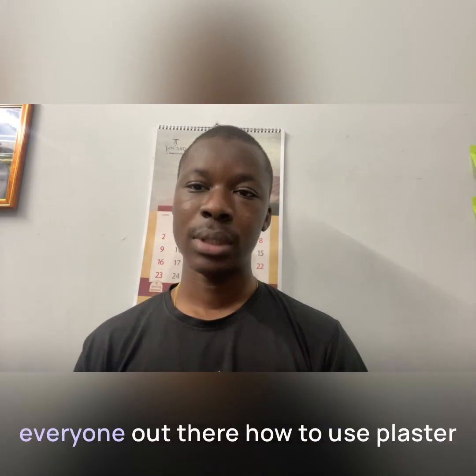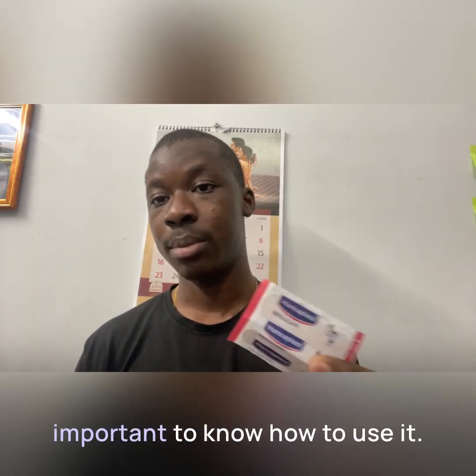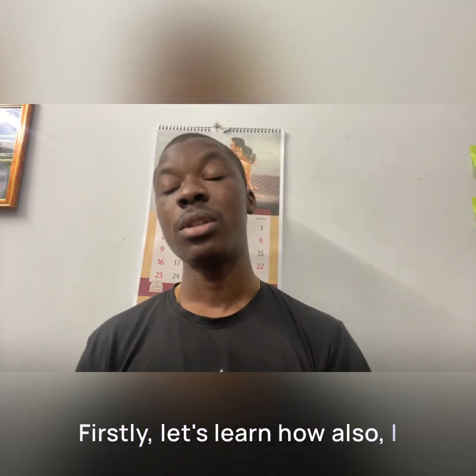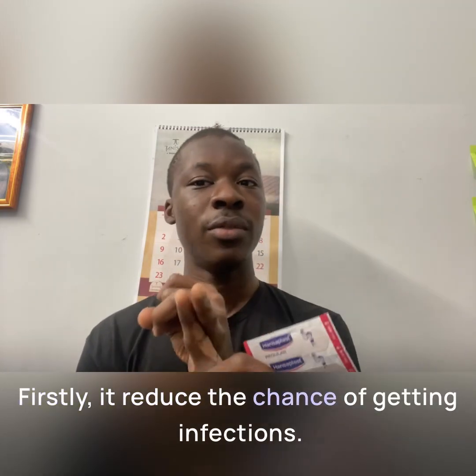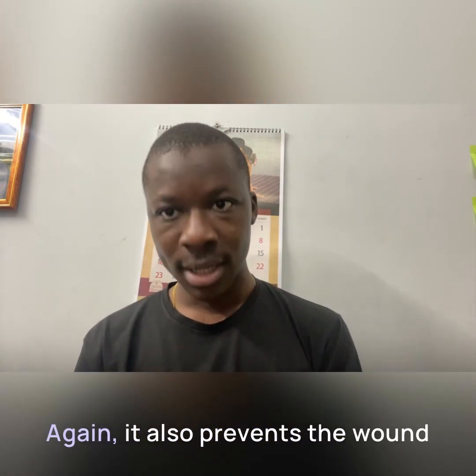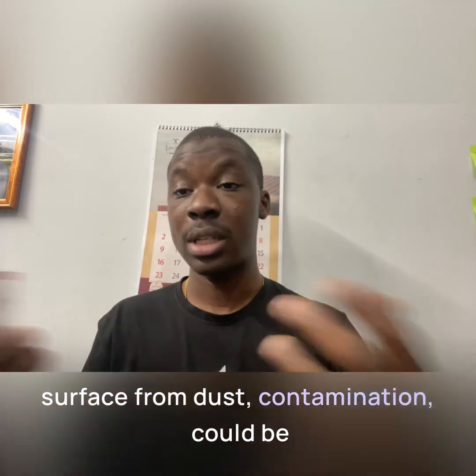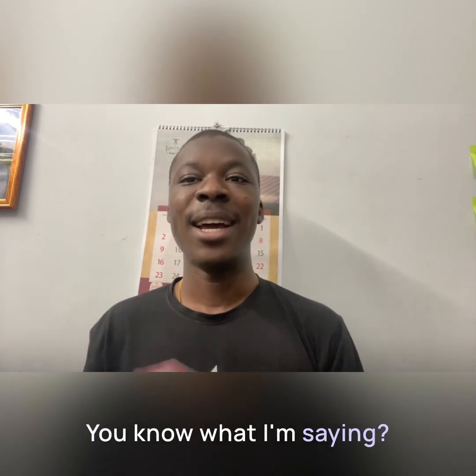I think I need to explain to everyone out there how to use plaster, because it's very essential and very important to know how to use it. Firstly, let's learn the functions of plaster. It reduces the chances of getting infections. It protects the wound surface from external injuries. It also prevents the wound surface from dust and contamination. It could be chemical, it could be anything.